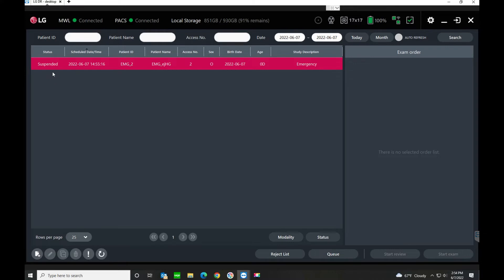The benefit of that is you come in, select on them, and you can begin your study without having to type in the patient's name, birth date, sex, study description, et cetera. The PACS being connected means that once we're finished with our studies, we end the exam and they send directly to your archive, from where you can look at them on different viewers in your practice.